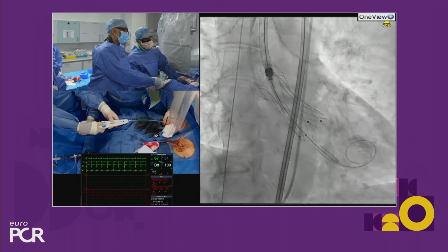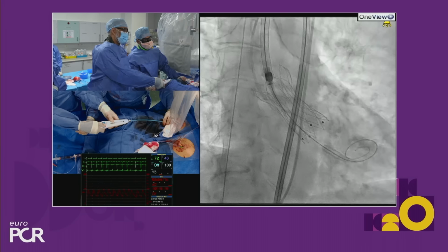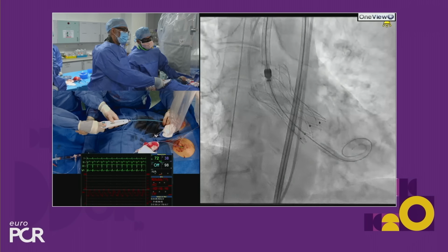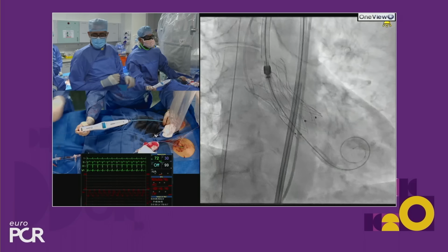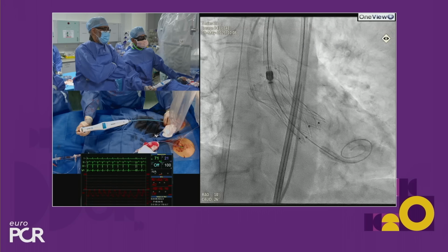One still attached. Yeah. And one still attached. And there it's pinged. And that's taking its shape. There's just one port still, isn't there? And there we go. That's the last one out. Okay, so save that, please. Okay, superb. So, Neil, talk us through retrieving the capsule.